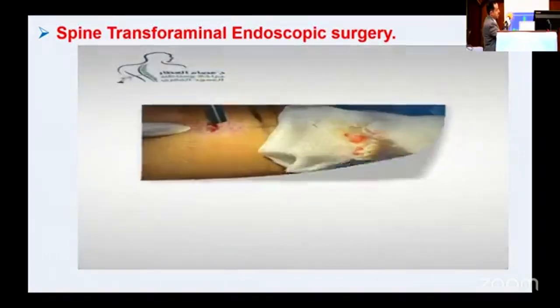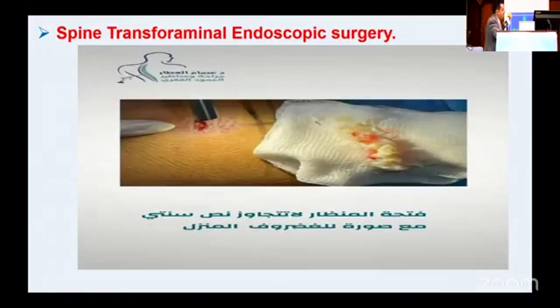Now you see this is the disc, and this is the incision. It is only maybe half a centimeter, a small incision. The patient goes home after surgery without antibiotics. Maybe sometimes we give them amoxicillin post-operatively.